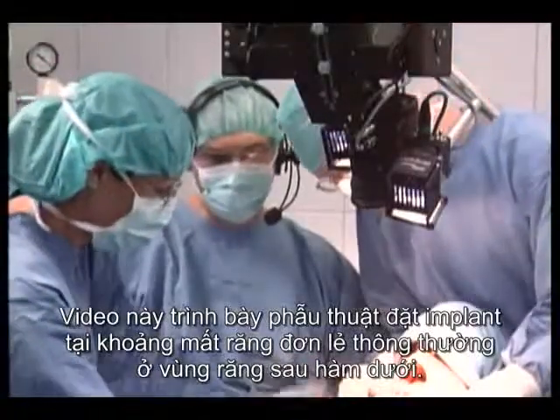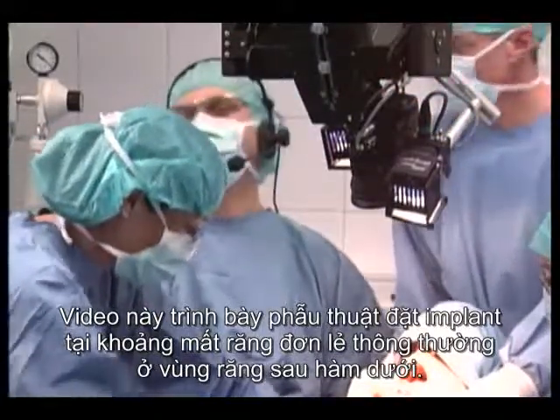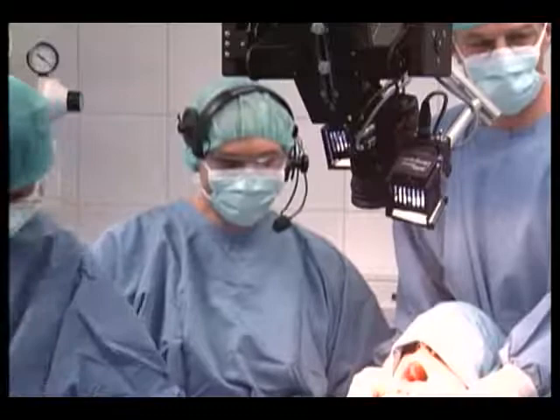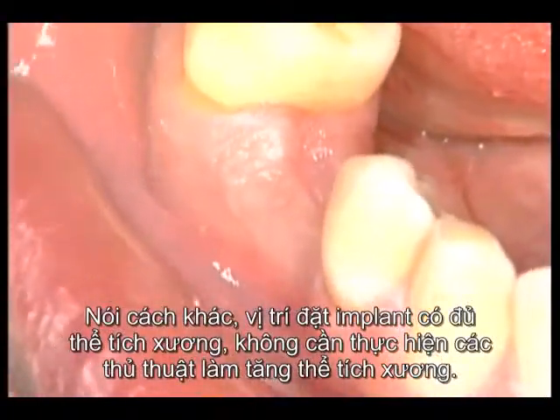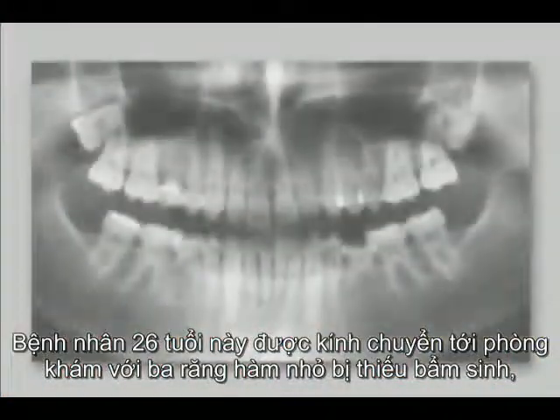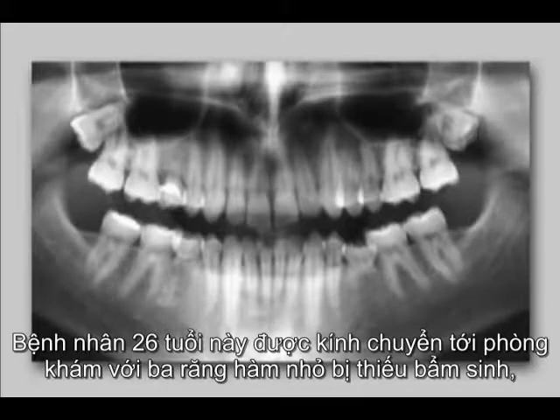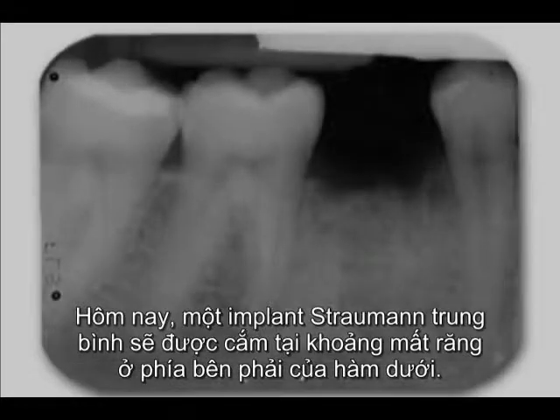This surgery shows a patient with implant placement in a standard single-tooth gap in the right mandible. In other words, in a site with sufficient bone volume, requiring no bone augmentation procedures. The 26-year-old patient was referred to the clinic with 3 congenitally missing premolars, 1 in the maxilla and 2 in the mandible. Today, a Straumann standard implant will be inserted in the right mandible.